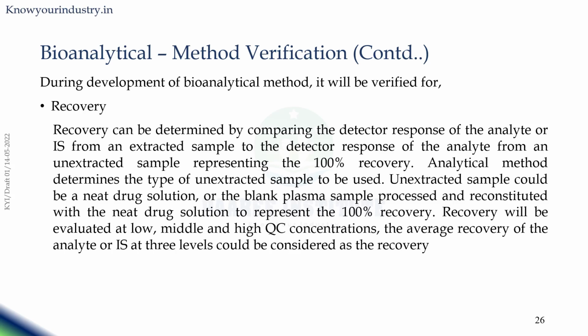So what is an unextracted sample? You can say an aqueous or neat solution, whatever the solvent, to which you are adding the drug and making the solution, which is having 100% recovery. That means the neat solution of the drug is 100%, or a blank plasma sample where you add the neat drug solution, which can be called 100% recovery. The recovery will be evaluated at low, middle and high QC concentrations, and the average recovery of the analyte and the internal standard at three levels could be considered as the recovery.